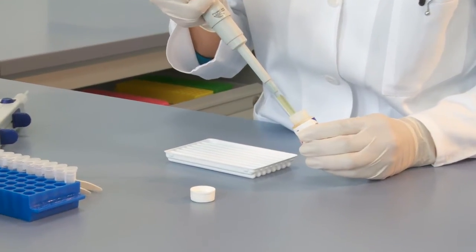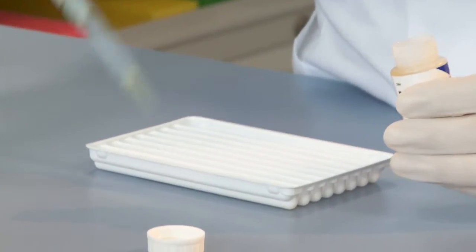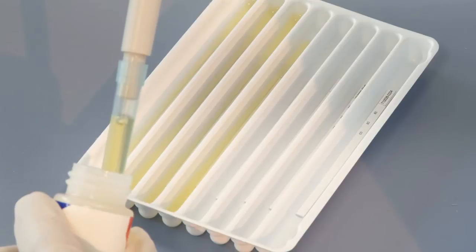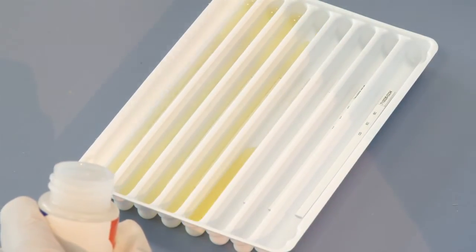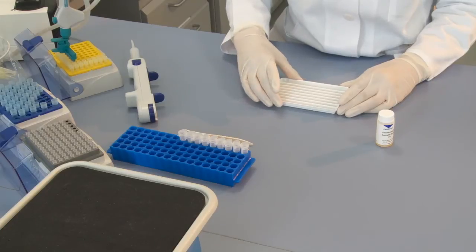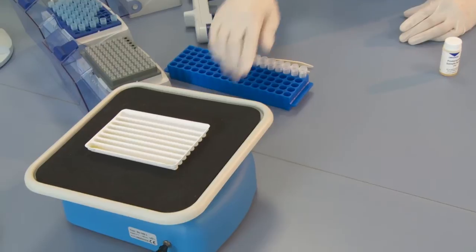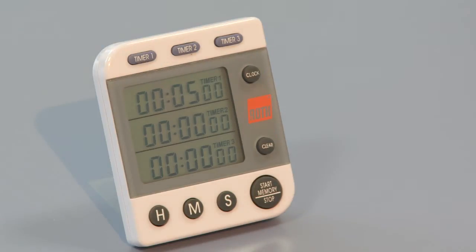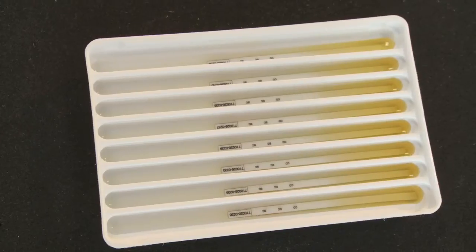One milliliter of sample buffer is now pipetted into each tray. Be careful that the pipette tip does not touch the strip. Subsequently, the strips and the tray are incubated for 5 minutes on the rocking platform. This step ensures even wetting of the blot strip with sample buffer.